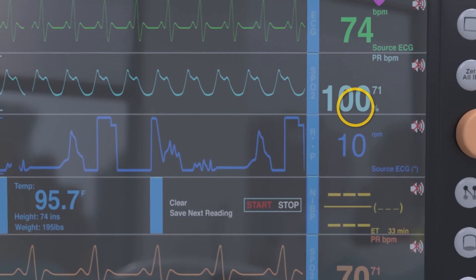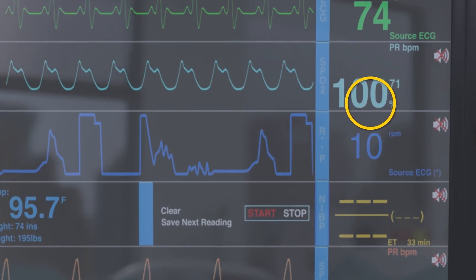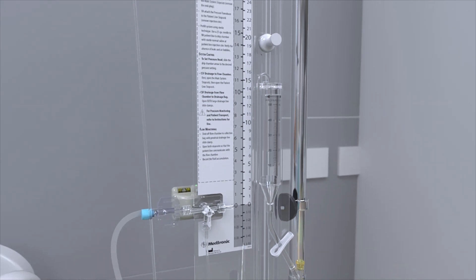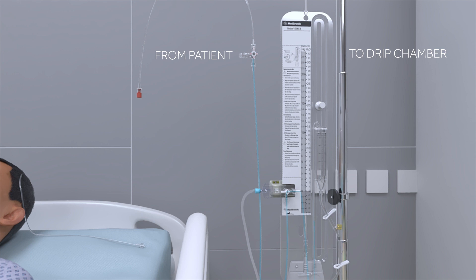Zero the transducer and monitor according to the manufacturer's instructions. Once the pressure transducer has been zeroed, adjust the drip chamber back to the prescribed setting. Finally, adjust the main system stopcock so that it is turned off to the transducer, thus allowing fluid flow from the patient into the drip chamber.